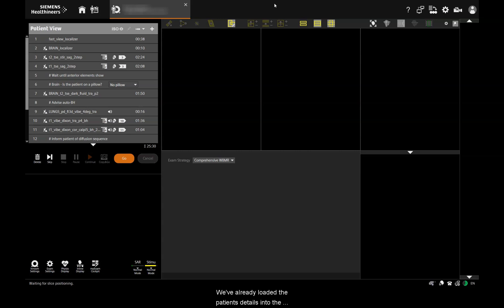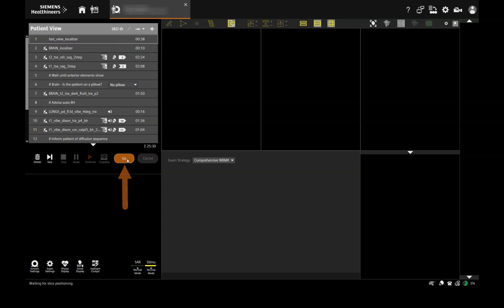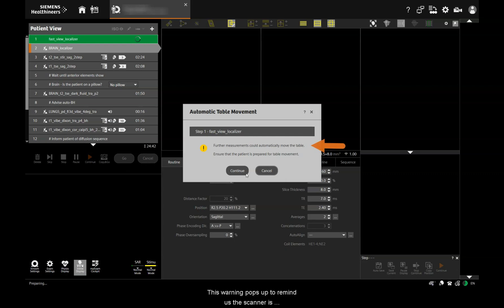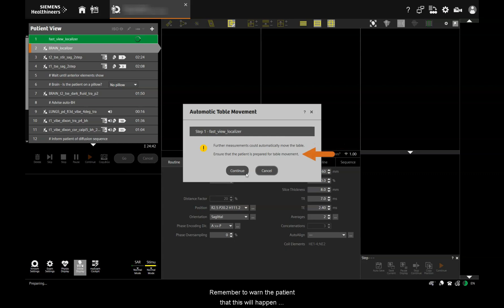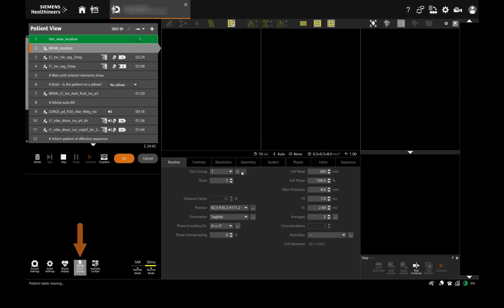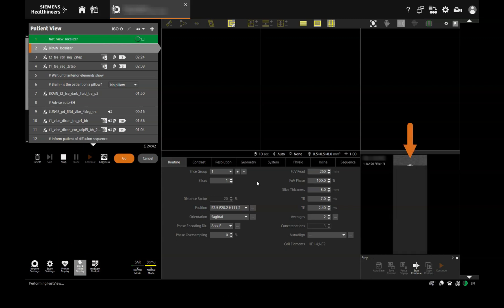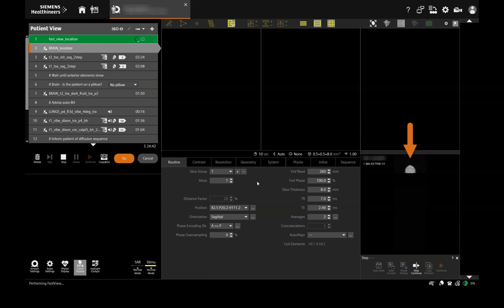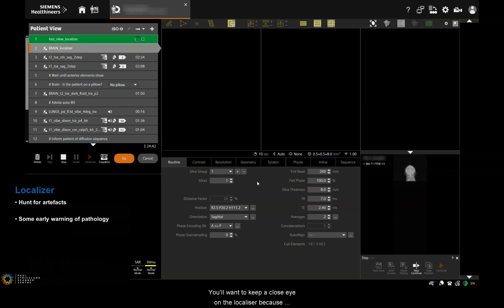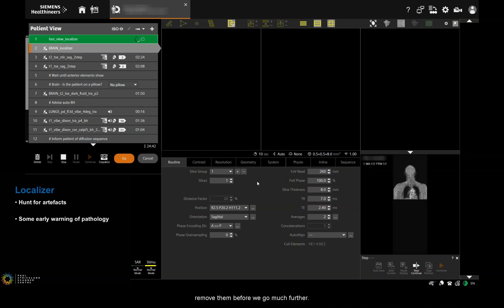We've already loaded the patient's details into the scanner and we're ready to begin. First up is a fast view localiser. This warning pops up to remind us that the scanner is going to move the bed automatically — remember to warn the patient that this will happen throughout the scan. You can click the inline display button to watch the progress of the localiser. Keep a close eye on it because if the patient has managed to get through screening with any remaining metallic objects, now's a good time to remove them before we go much further.